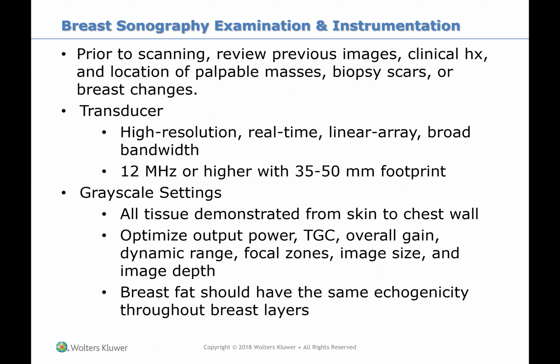A lot of the times when you're doing a breast ultrasound, you can ask the patient and they can fill you in, the younger patients. Now, if you're doing a diagnostic ultrasound where they had a mammogram first and they saw something, usually the mammo tech will talk you through where it is. So then you have an idea.